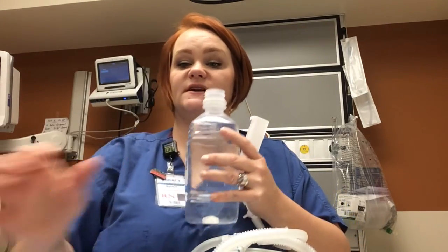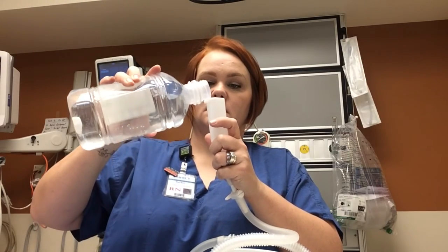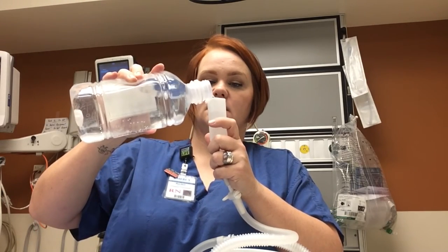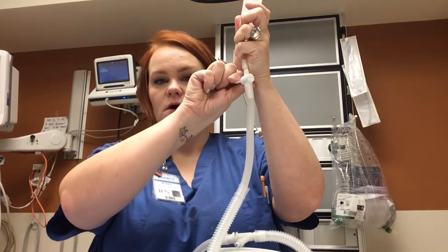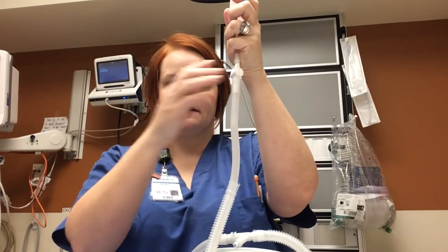This is also used with sterile water, not saline. So go ahead and fill that up. Once you've got it nice and full, go ahead and open it. The water will drip down. And that's it for that device.